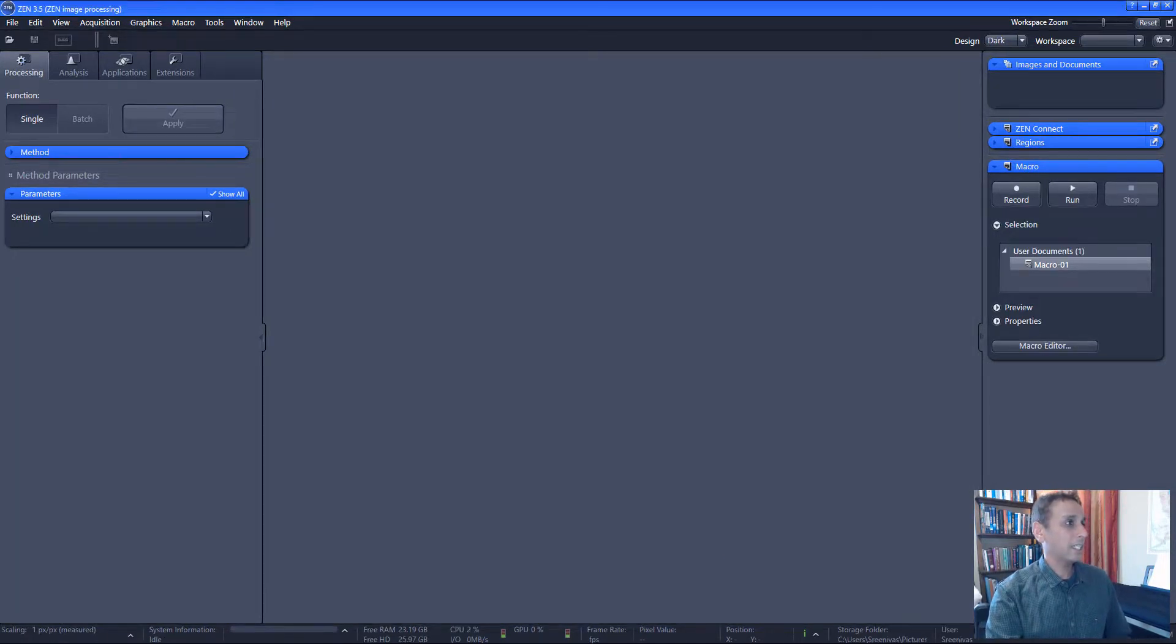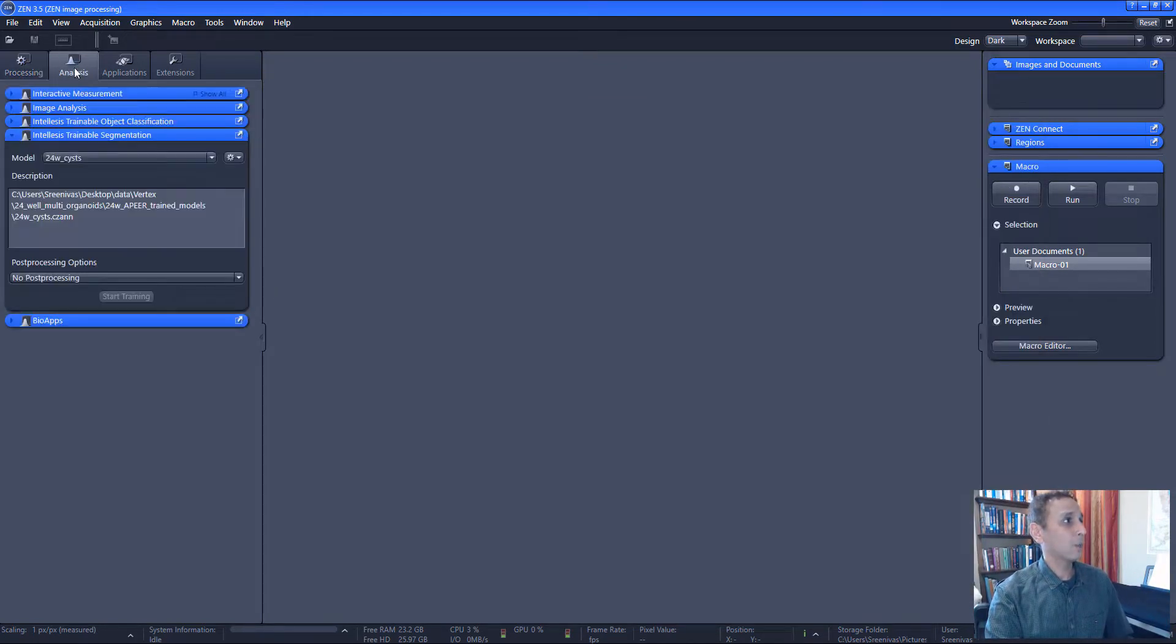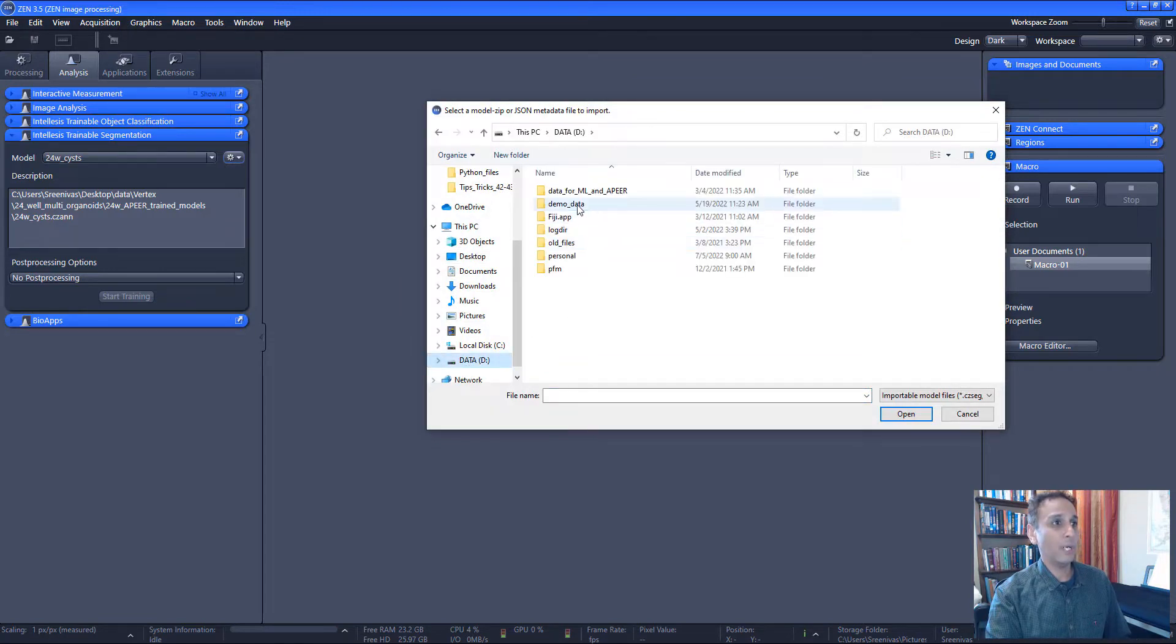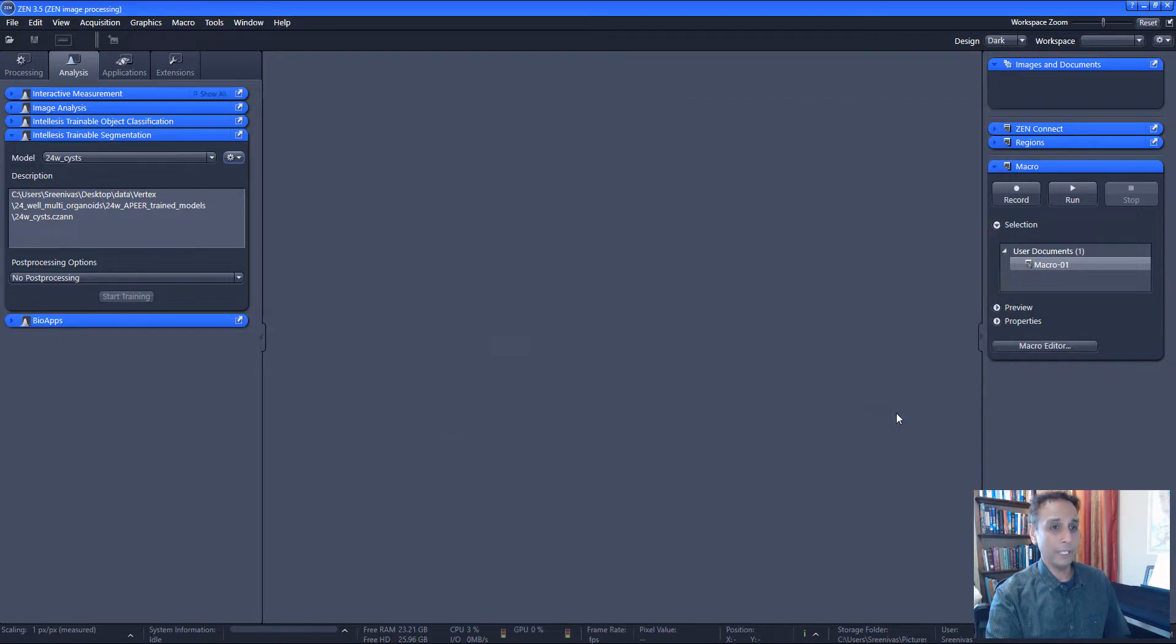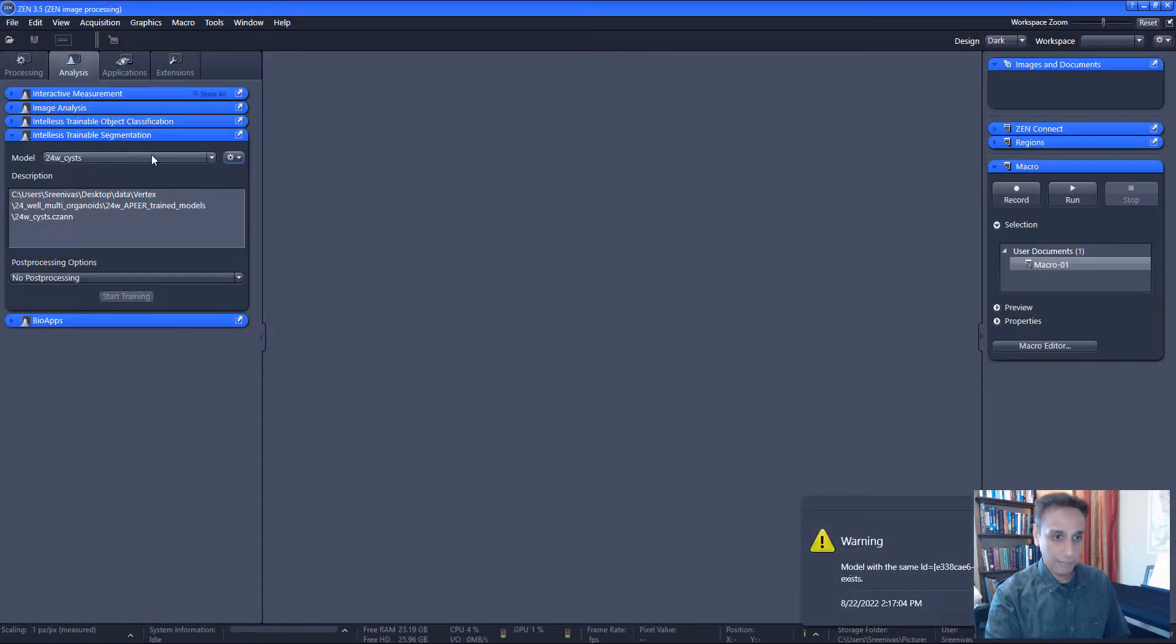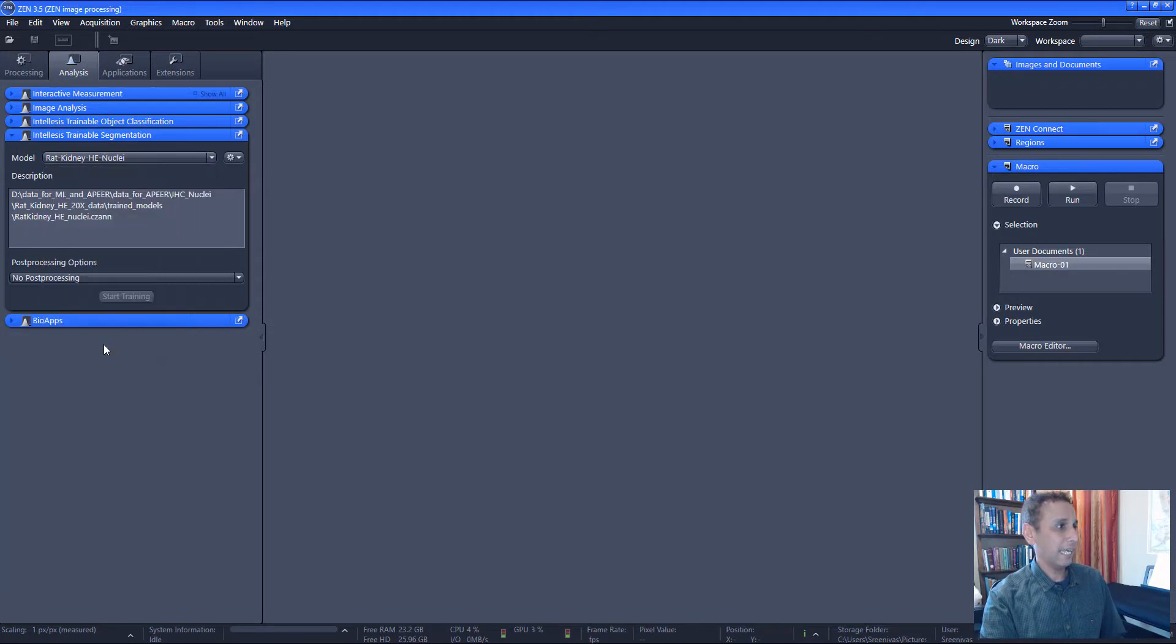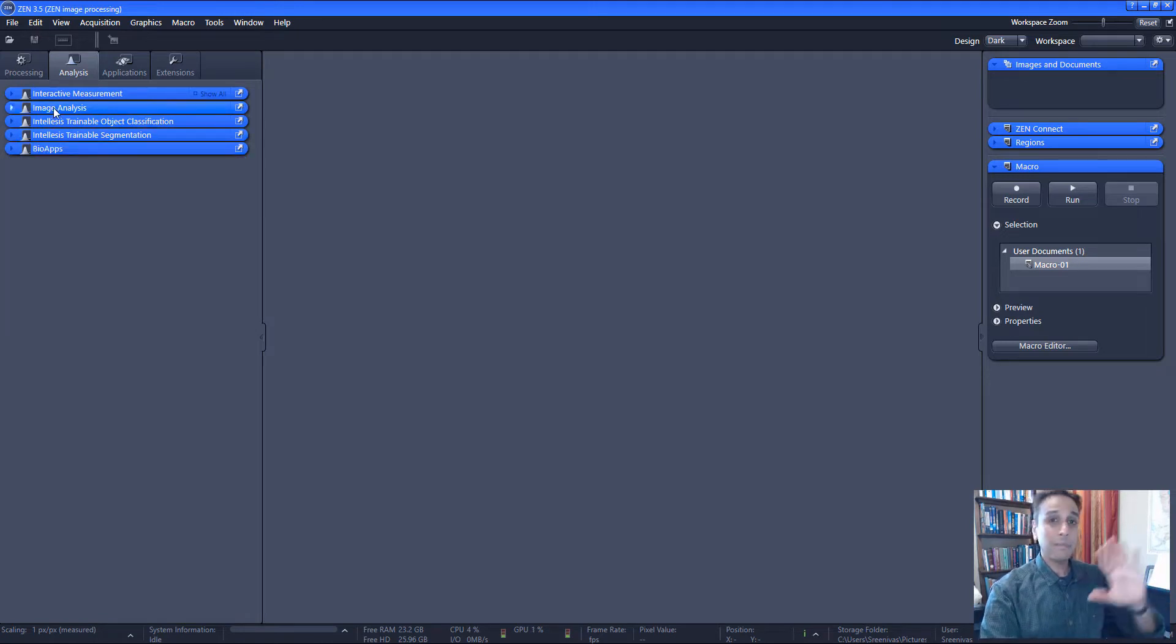Now let us start by importing the trained models into Zen first. And you must have IntelliSys in Zen. So let's go to analysis and find the IntelliSys trainable segmentation and import. And let's go ahead and import our rat kidney trained models. I renamed them here. So you can see I am importing the glomeruli. And let's say OK. And we should see the model. It's given a warning. It says the model with the same ID already exists. Well, I imported this model earlier. So it's giving me that it's exactly the same model. So as you can see, I have the glomeruli, I have the nuclei, the two models that we just created.